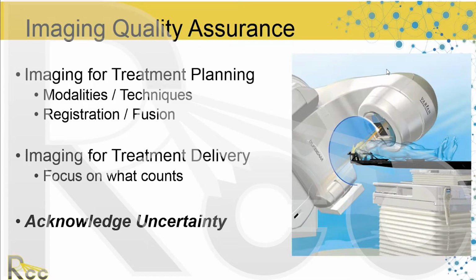When I first started using more PET CTs in my practice, it wasn't always apparent to me that because the PET CT is taken over a long period, the CT associated with the PET might not quite overlay with the anatomy. So just fusing the two CTs together may be insufficient to get a good matchup. It's really important to look at that PET in relation to the anatomy, and that can't be overstressed enough.